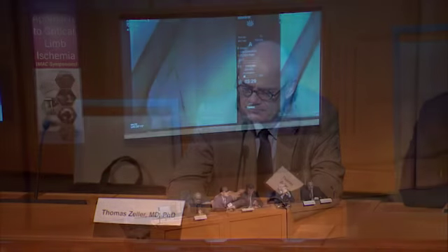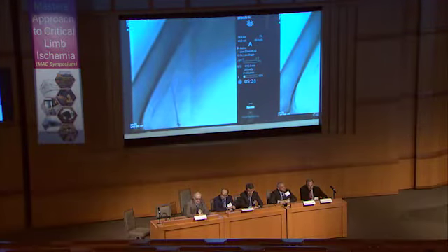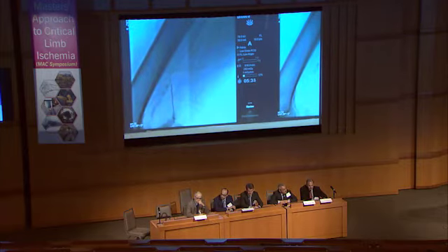Yes, the deep femoral, I think, needs angioplasty. I think that's a good point. The reason, Thomas, to go for the... but let me just show you this, and I'll give you the reason to go for the popliteal here.